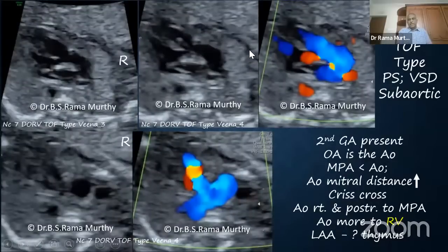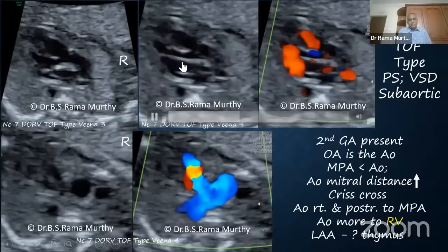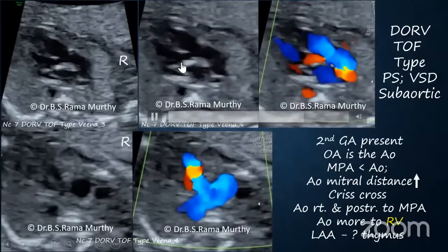Okay, I just want you to see this one clip. Dr. Manjusha, what is this valve? This descending aorta, LA, LV. So what is this valve? Mitral. Mitral, anterior leaflet of mitral, correct? Yes, sir. I also want you to see what is this valve over here.